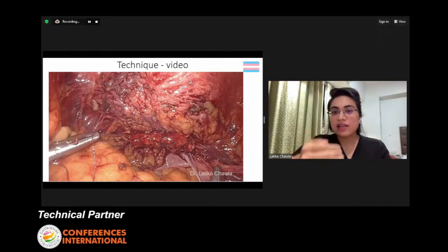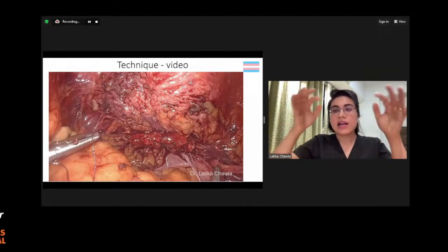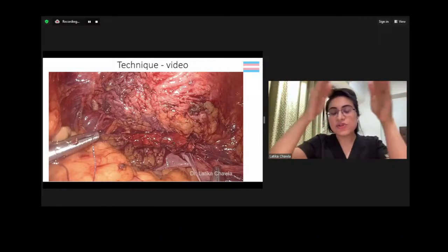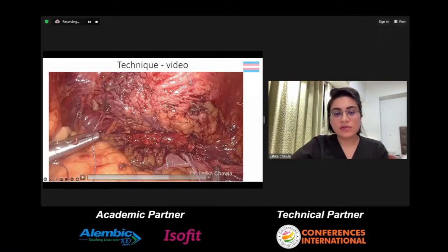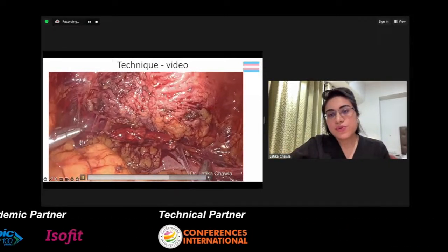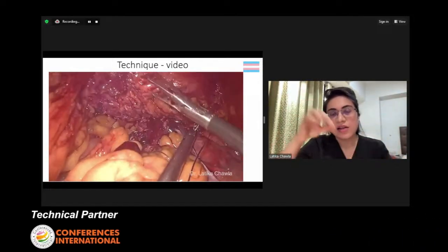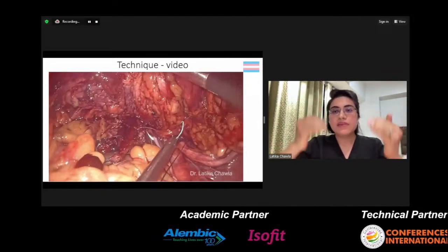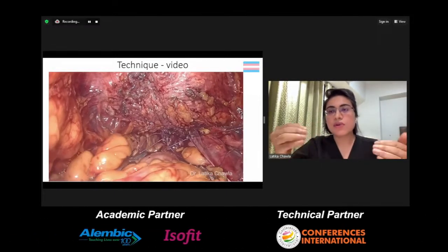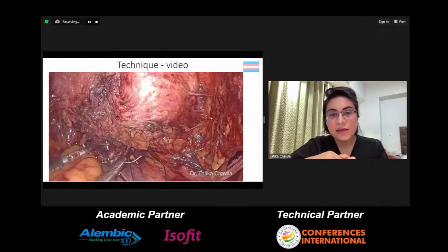So this is the anterior part that I have received, and on the other 3 sides, I have the peritoneum that I have harvested. And now I'm going to take sutures to attach the urethra to my peritoneum to create a tunnel. So we take continuous sutures using Vicryl number 1 in order to create a tunnel on both sides. Now we are above the levator ani here, so we are able to gain about 2 inches extra from above the levator ani, which is why we are able to provide better depth at the end of the surgery.